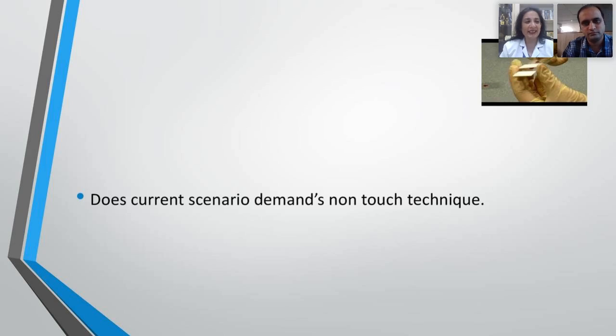So there is a complex series of events where we have a review mechanism; we review the slides before giving the diagnosis. An integral part is that the sample goes to the automated analyzer. Then there is a review criteria, which depends majorly on how you, as a lab, have devised your own review criteria basis the ISLH guidelines, basis your middleware link, whatever you are using. And the slides which do not comply with the review have to go to manual review.